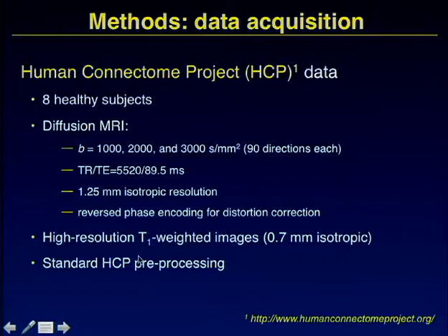And then we also use the data they have for anatomical imaging for the processing, and we did the standard pre-processing that they recommend for the pipeline for the Human Connectome Project.